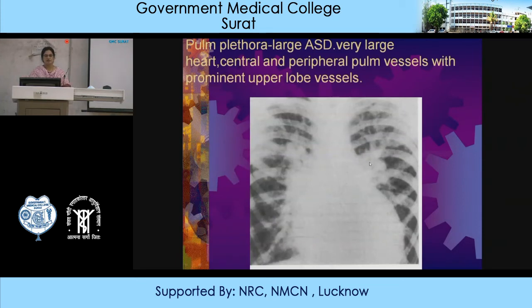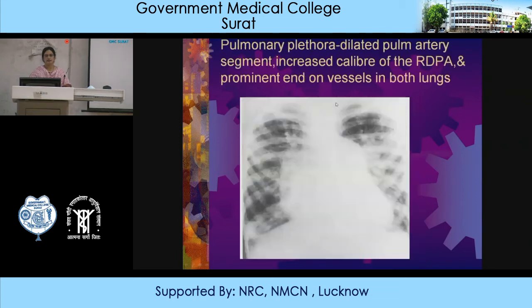Another case of pulmonary plethora showing a dilated pulmonary artery and dilated pulmonary artery segment. There is increased caliber of the right descending pulmonary artery and prominent end-on vessels located in both lungs.